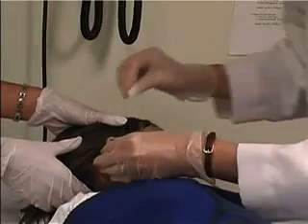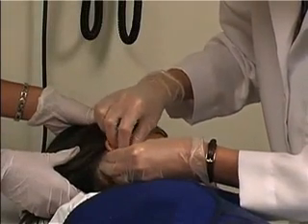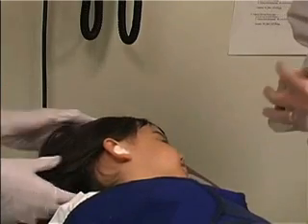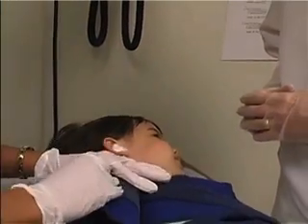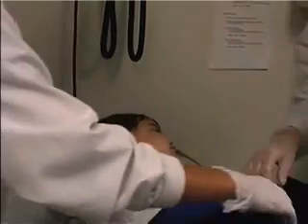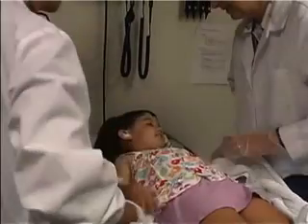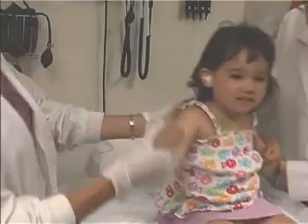In case of profuse bleeding from either the external auditory canal or a high-riding jugular bulb, the external auditory canal can be packed with a cotton ball soaked in oxymetazoline. Having the child sit up and having the parent soothe the child to reduce the pressure caused by crying may also help reduce bleeding.